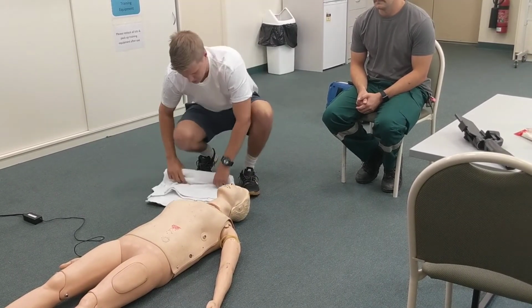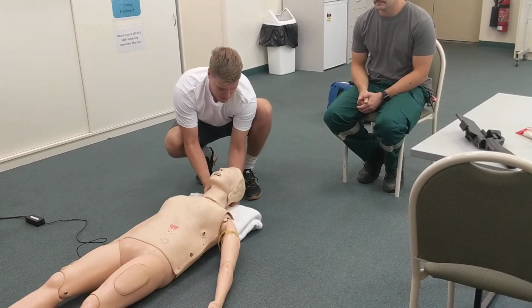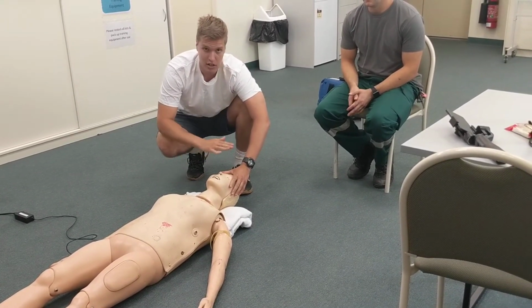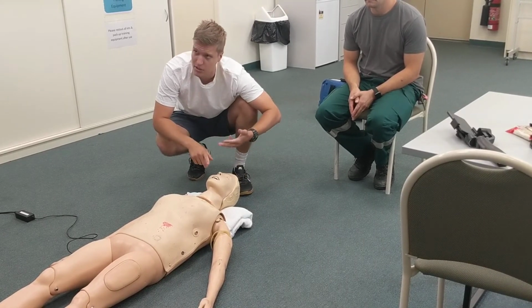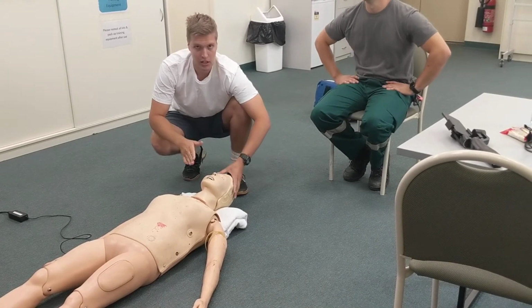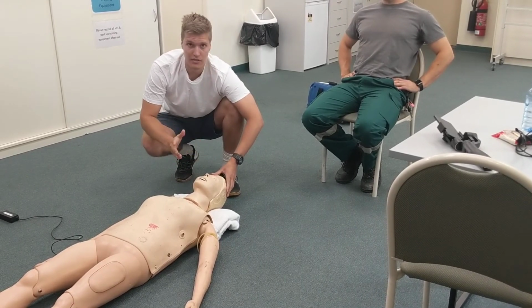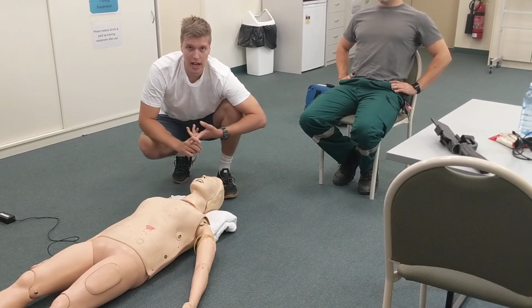In doing so, we can use things like blankets or our kits in just a small sort of ramping underneath the back and shoulders. What we're trying to do here is get the 3-axis alignment theory with their mouth, oropharynx and larynx, I believe it is. Have a quick look at that, yep. All in line, so we've got a good view through direct laryngoscopy, or if you can use a video laryngoscope, even better, just to mitigate the issues during intubation.